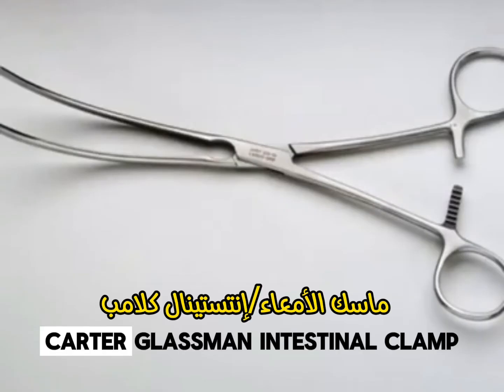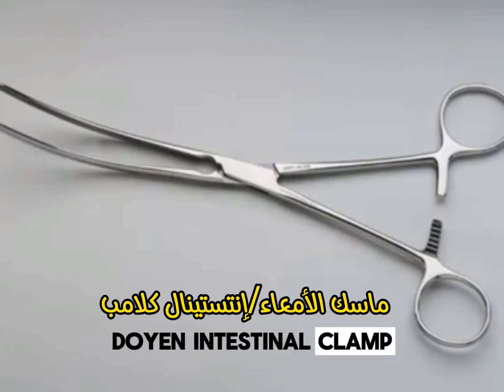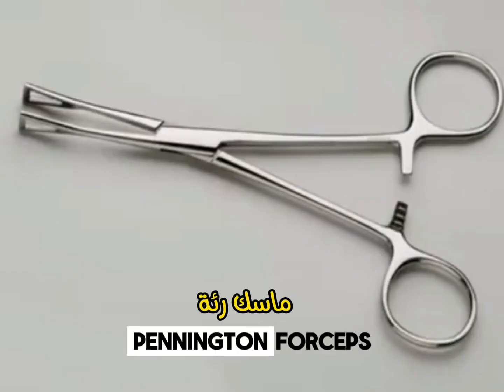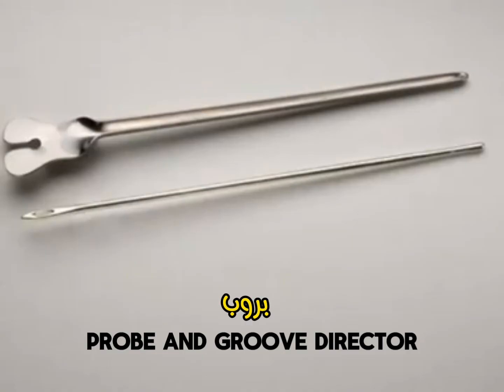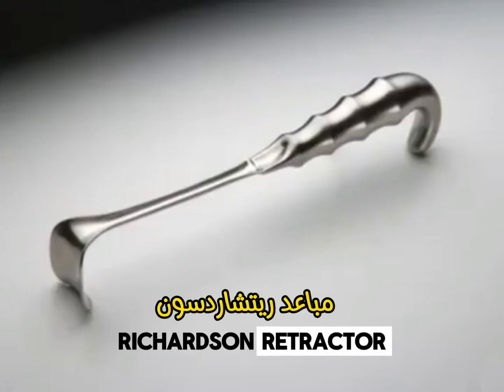Carter Glassman Intestinal Clamp. Doyen Intestinal Clamp. Pennington Forceps. Probe and Groove Director. Retractor. Richardson Retractor.